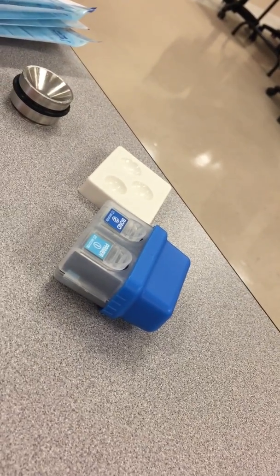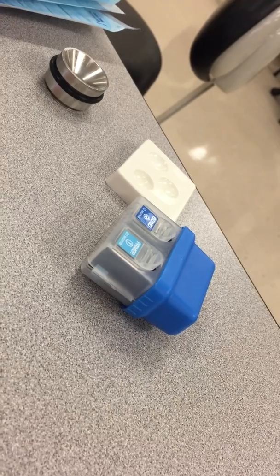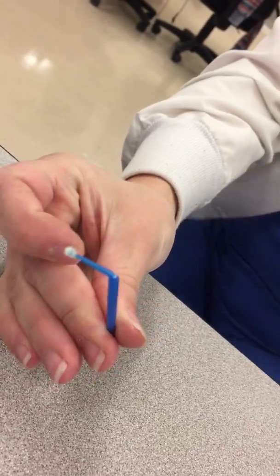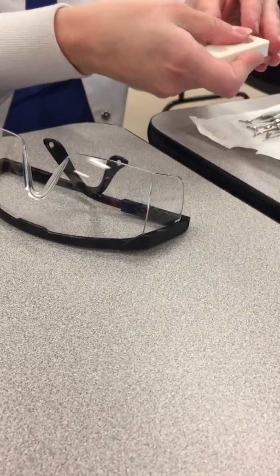Okay, so put your prime and bond in the prime and bond well, and then you are going to use these, which are called micro brushes or micro brush applicators. And they look like that. So I'll pass that around for everybody to see with the well and the prime and bond. Okay, and what you would do is you would dip it first and pass it to the dentist. He would use it, and then if he needed more, you would actually dip it for him. Okay? So he doesn't do any work at all, he just holds it? Yes, micro brush. He just holds it like this. And I would just... Okay, and then it'll work with it.